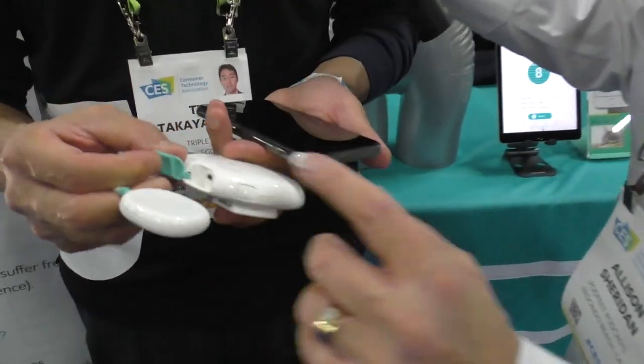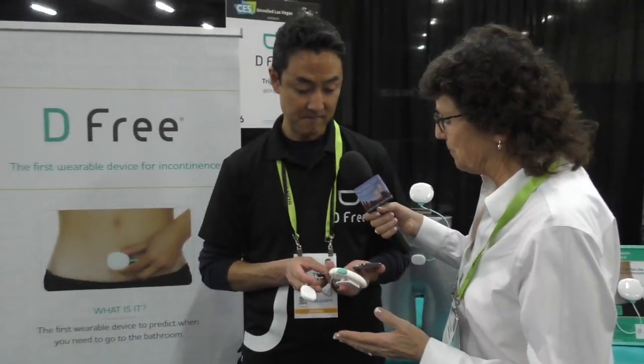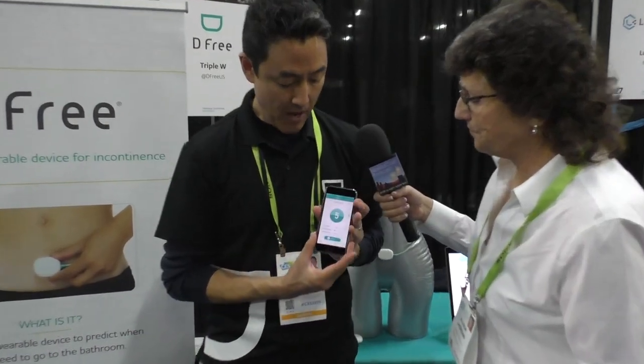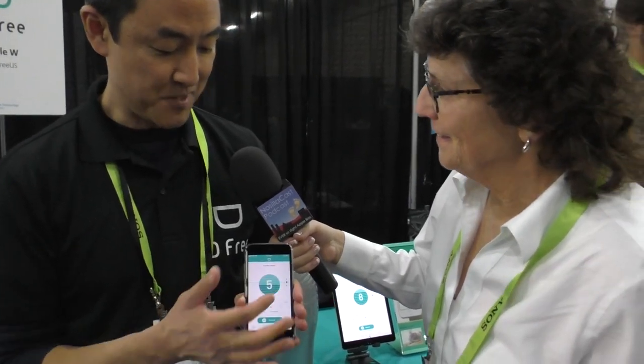The app itself is where the fun happens. Tai is actually wearing his sensor right now, and this is what his bladder looks like on the app. His bladder is 50% full, and he typically has to go when it's 60% full, so he's getting very close. Bold of him to show us his bladder live on camera!